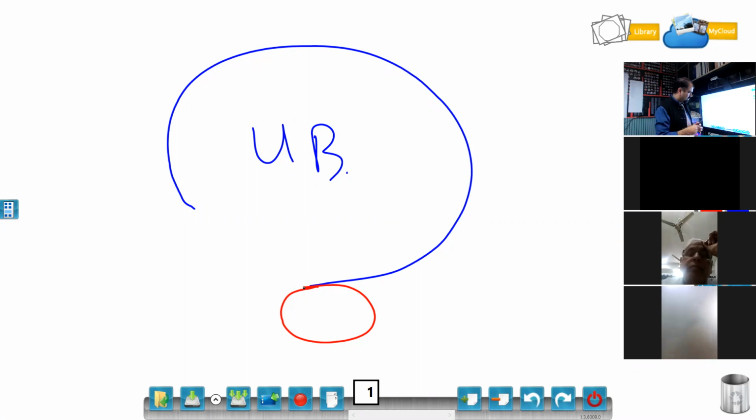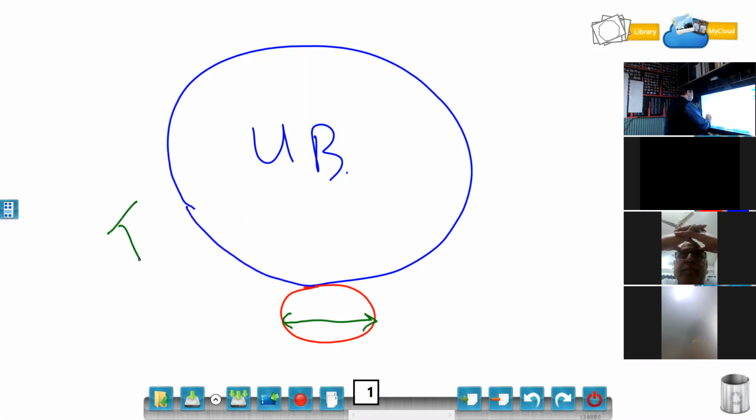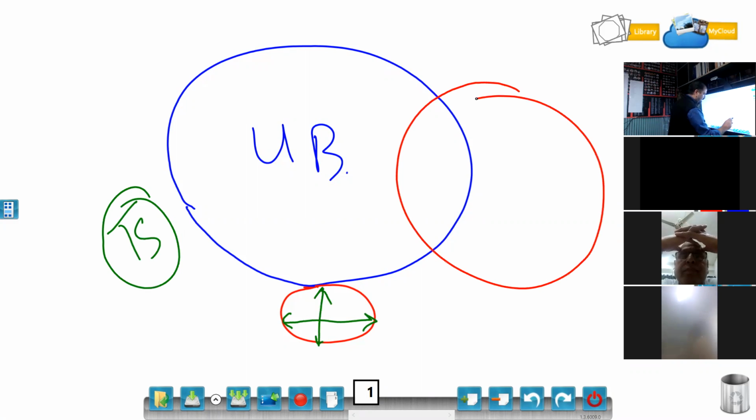We have discussed this in physics multiple times. Now I have to take the first measurement, because I am in transverse section. Whenever I'm in transverse section, I will be taking the width, and I can take the depth from here. But for length, I have to take the prostate in length. Then only I can take the measurement over here.